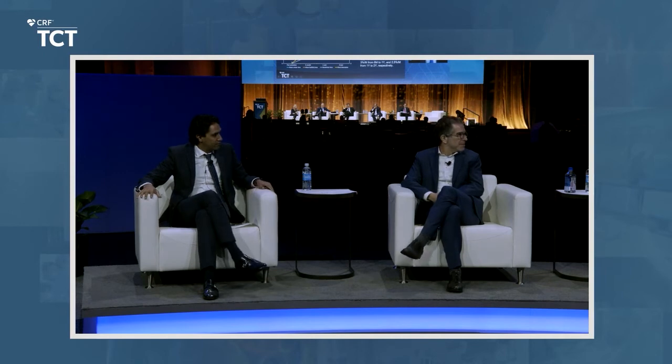But I think what you bring up, Alexandra, is the concept of pulse management. Do you just dump all 80 pulses into the most calcified segment? I think the answer to that is no, because you can see that we still need to modify the eccentric lesions. So we should use our 80 pulses in the context of the ability of the balloon to expand, but use 10 pulses in the other areas of the 45 millimeters that are calcified in order to get modification in all of the calcified segment. Right, I cannot disagree. And I wonder if there are any other metrics, like the thickness of calcification, the length of calcification. All those things I think will be part of the future, in trying to understand how best to apply the treatment.